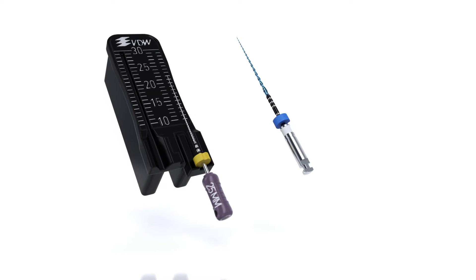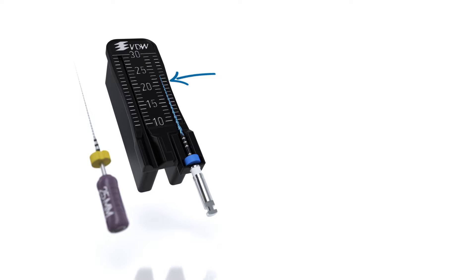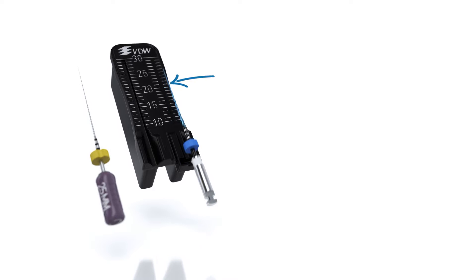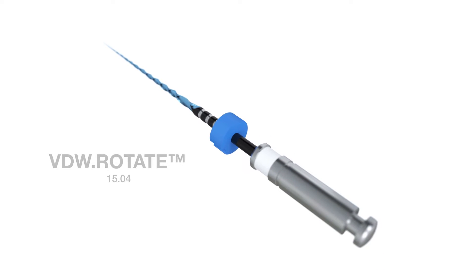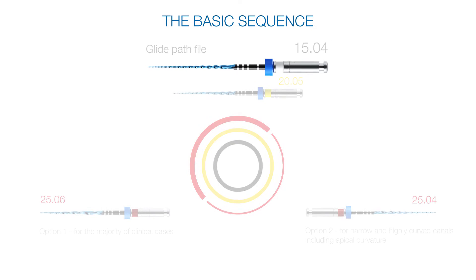Transfer the working length with a measuring gauge from the C pilot file to the VDW rotate 1504 instrument and set the blue stopper accordingly. Begin preparing with the glide path file VDW rotate 1504, the first instrument in your VDW rotate basic sequence, and create a reproducible glide path until the working length is reached.